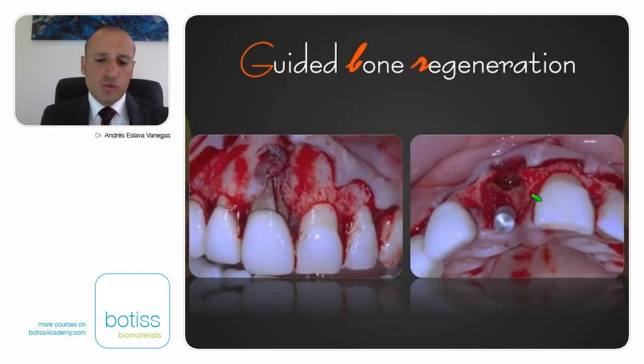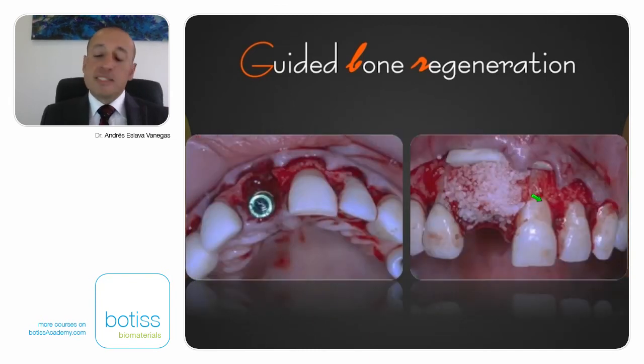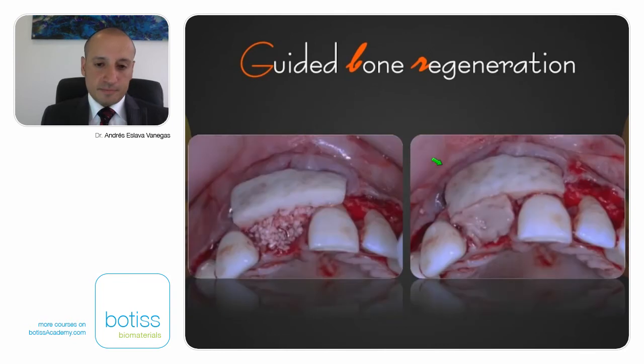So we raise a huge flap, we extract the tooth, we can see the vertical root fracture, and we say, okay, we can do our dental implant and we can do our bone graft and we can get better gingival biotype. So we put the implant in the correct 3D position. There are a lot of things. We put our implant. We use bone graft exclusively. In this case, we use xenograft and growth factors. And we leave a healing abutment at this time. And we put our dermal graft. Okay? This was maybe 6 years ago.